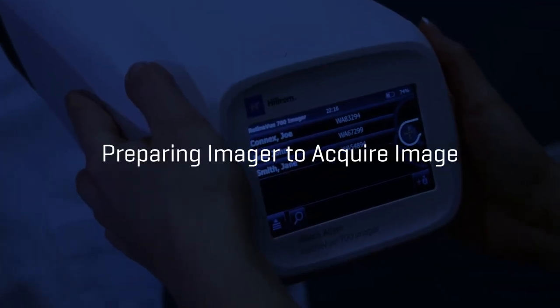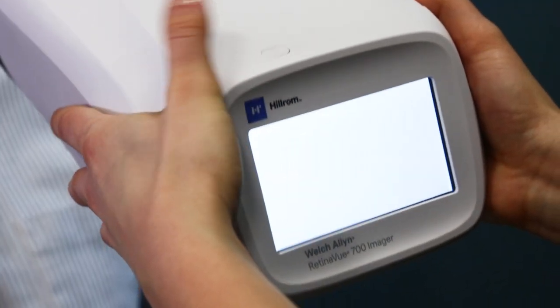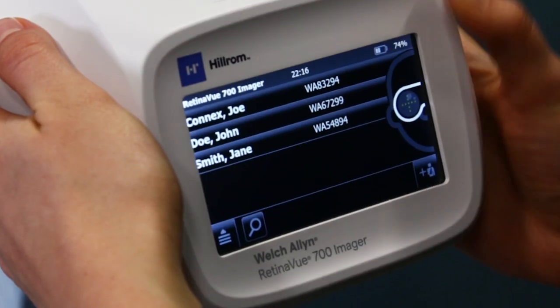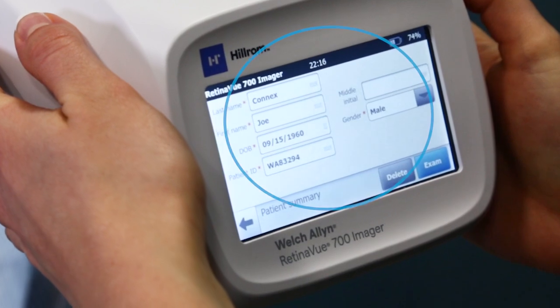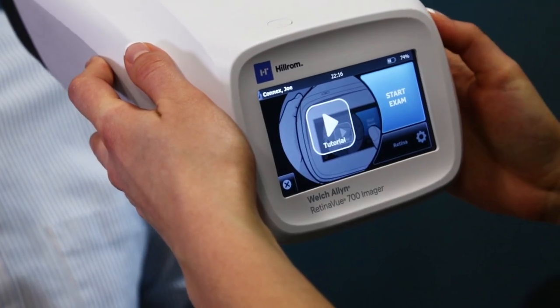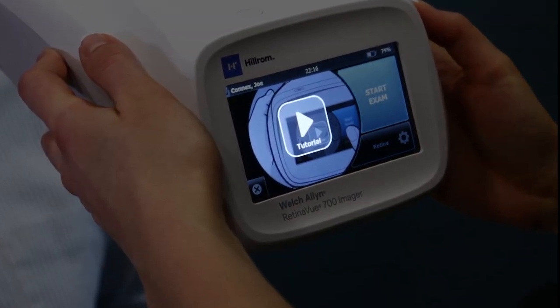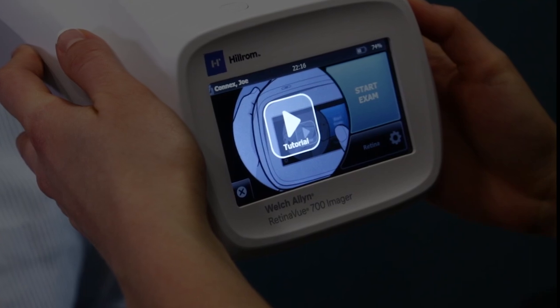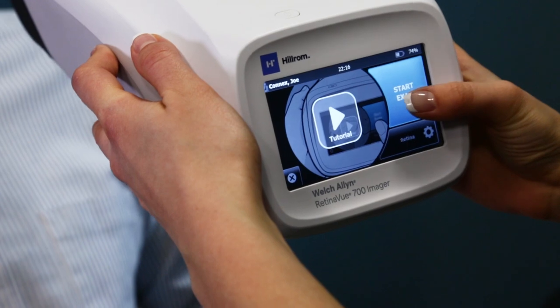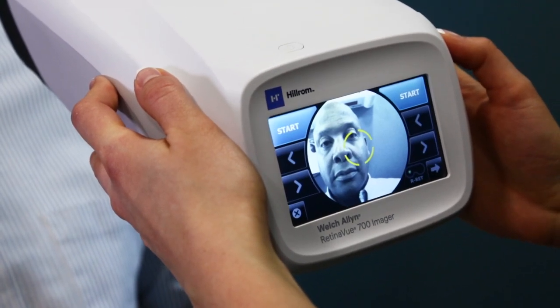Preparing the imager to acquire an image. Turn the imager on. After boot up, you will be presented with the patient list screen. Select your patient and confirm the patient information. Touch Exam. If desired, touch on the tutorial to get a refresher on the proper technique to acquire an image. To acquire an image, touch the Start Exam button. You are now ready to acquire an image.